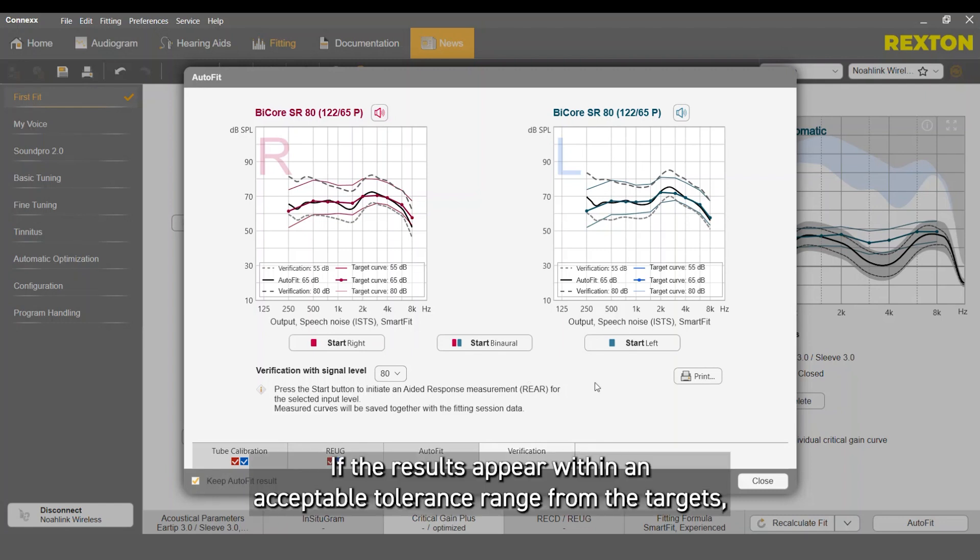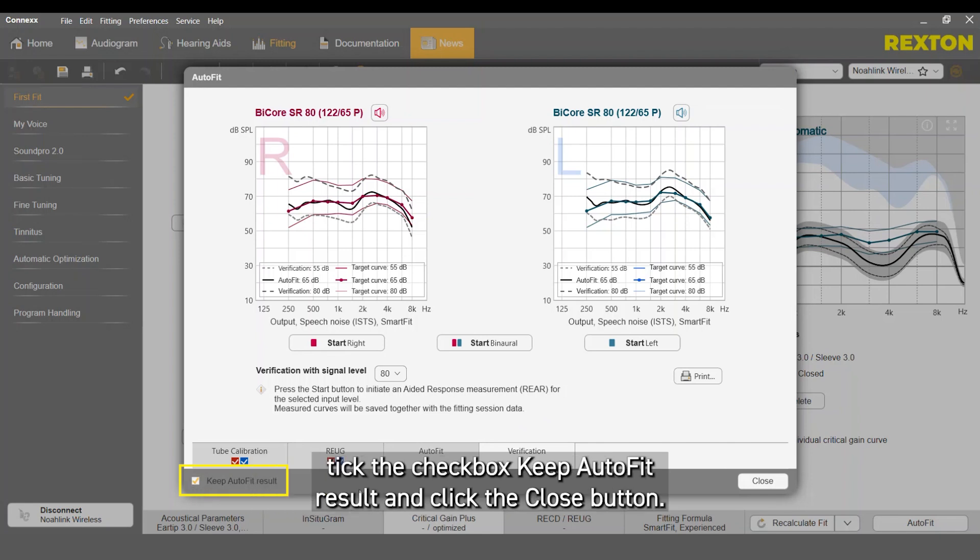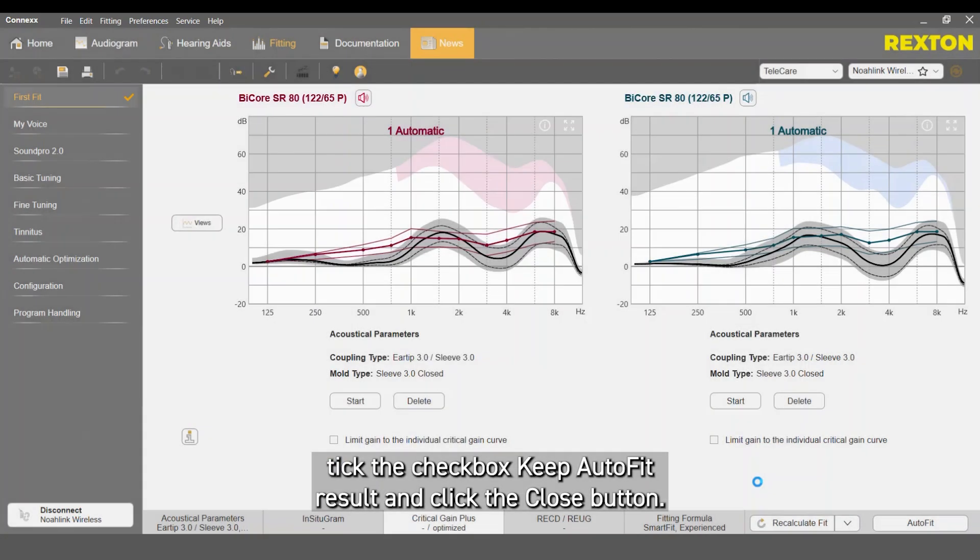If the results appear within an acceptable tolerance range from the targets, tick the checkbox Keep AutoFit result and click the Close button.